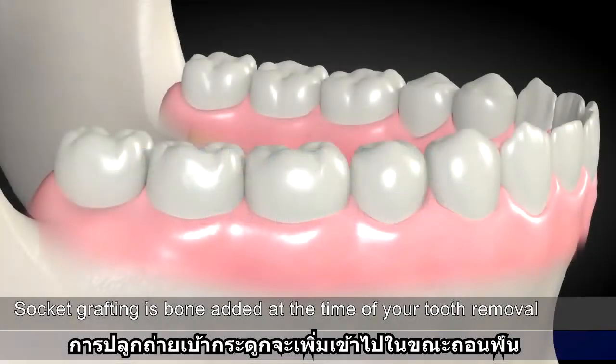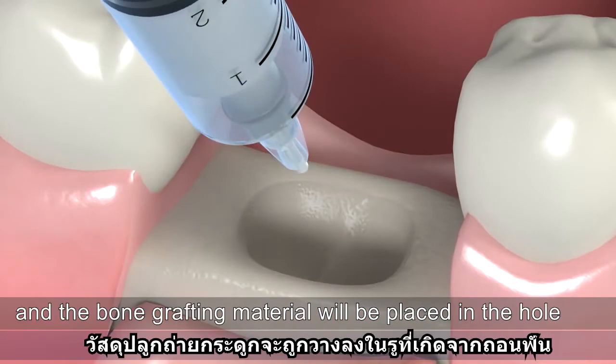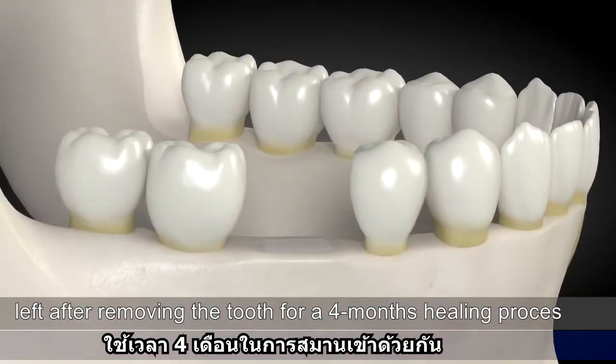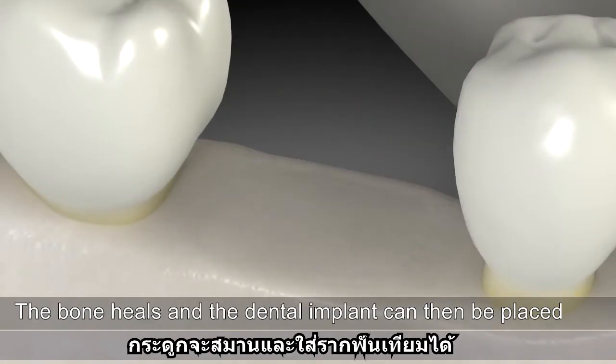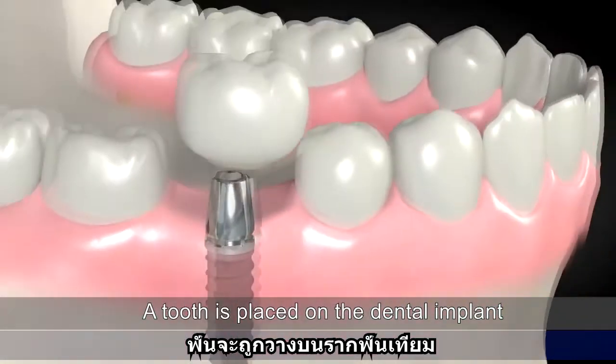Socket grafting is bone added at the time of your tooth removal. The tooth will be removed and the bone grafting material will be placed in the hole left after removing the tooth for a four-month healing process. The bone heals and the dental implant can then be placed, and a tooth is placed on the dental implant.